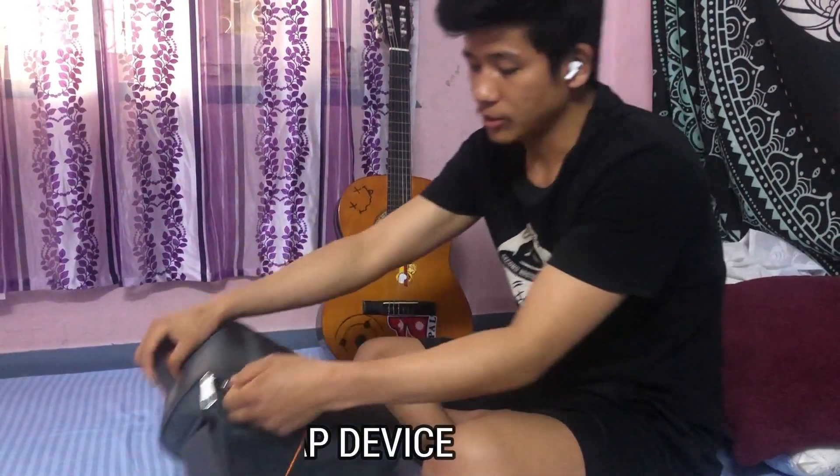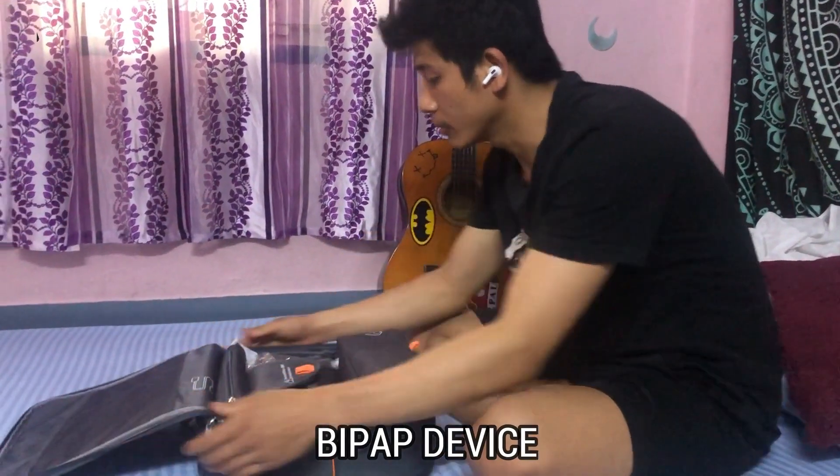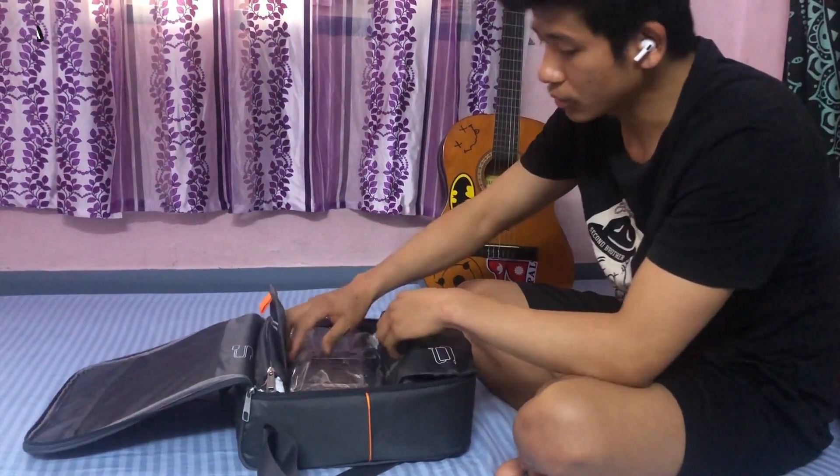Hello guys, I am here with an electric device, a BiPAP machine. I want to show you a few things that we have to look at.